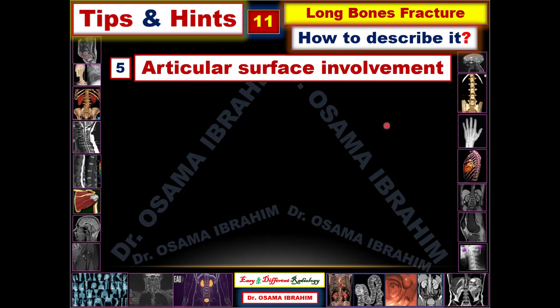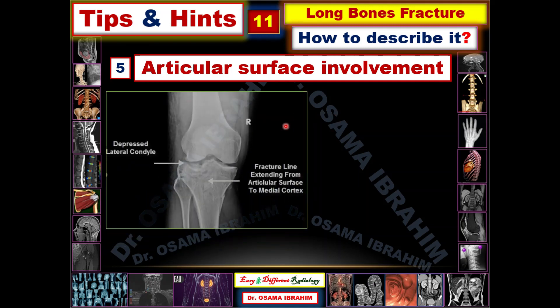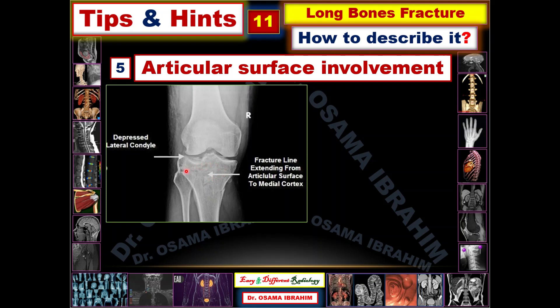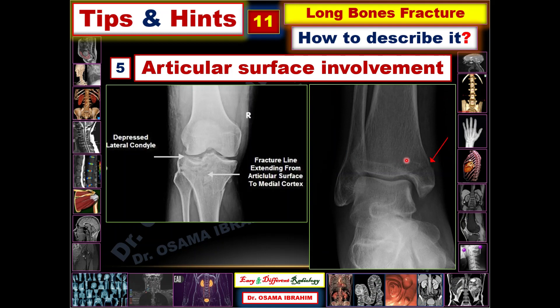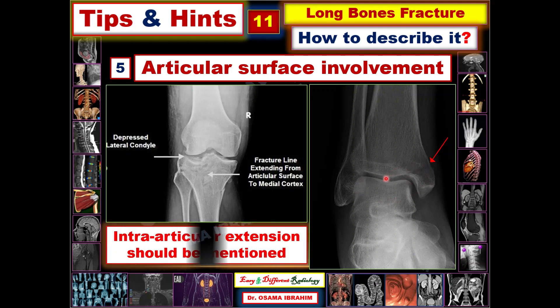Number five is articular surface involvement, and it is very important to mention in the report. For example, this tibia shows articular surface involvement, with the fracture line extending from the articular surface to the medial cortex. This is very important because it affects the joint. Similarly, a medial malleolus fracture with intra-articular extension to the ankle joint should be mentioned in the report. Intra-articular extension should always be mentioned.